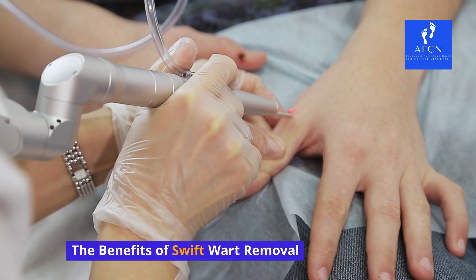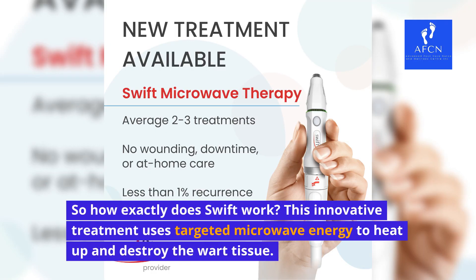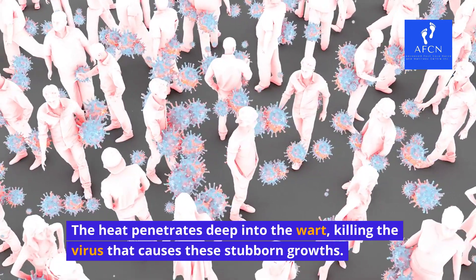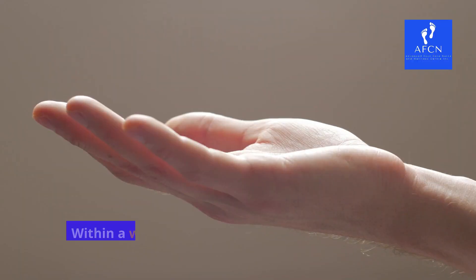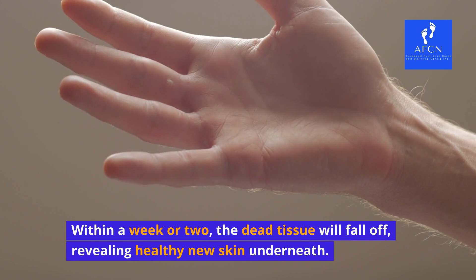The benefits of Swift wart removal. This innovative treatment uses targeted microwave energy to heat up and destroy the wart tissue. The heat penetrates deep into the wart, killing the virus that causes these stubborn growths. Within a week or two, the dead tissue will fall off, revealing healthy new skin underneath.